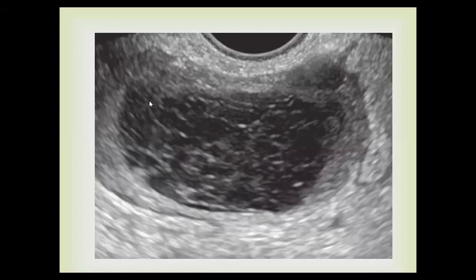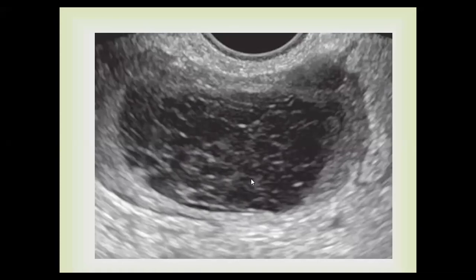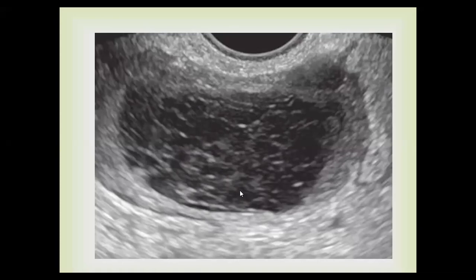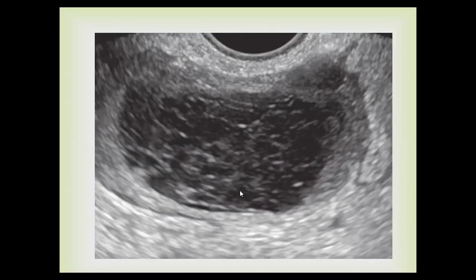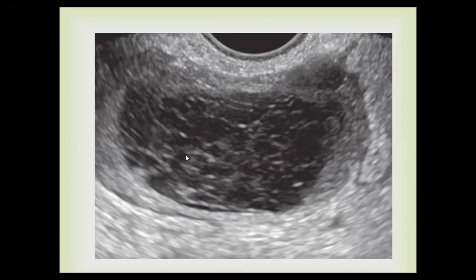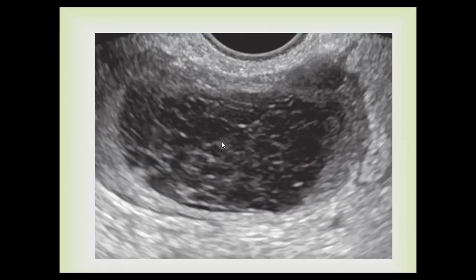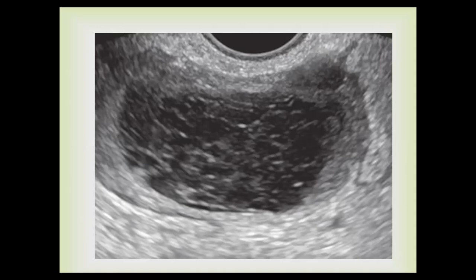It's one of the most confusing pictures and should be diagnosed well, because most of the management of these cysts is conservative.